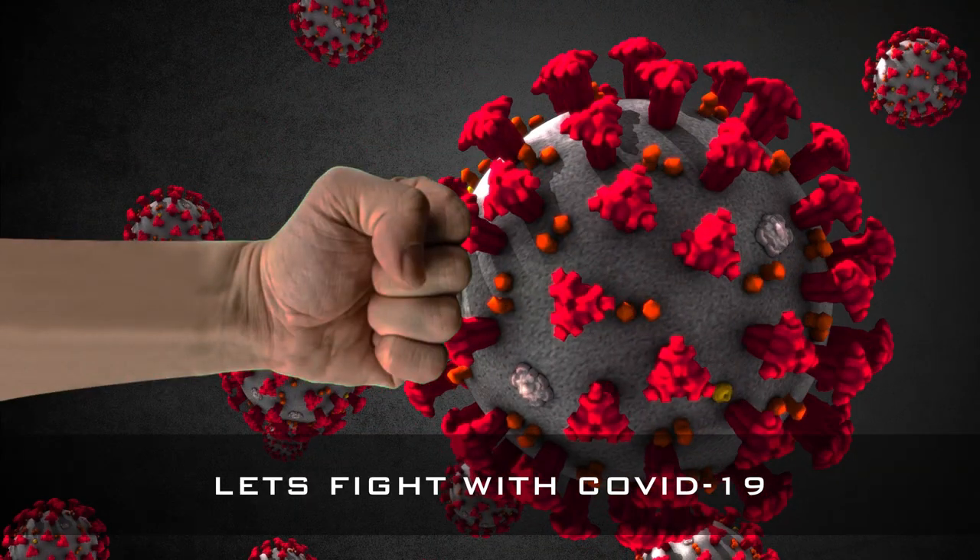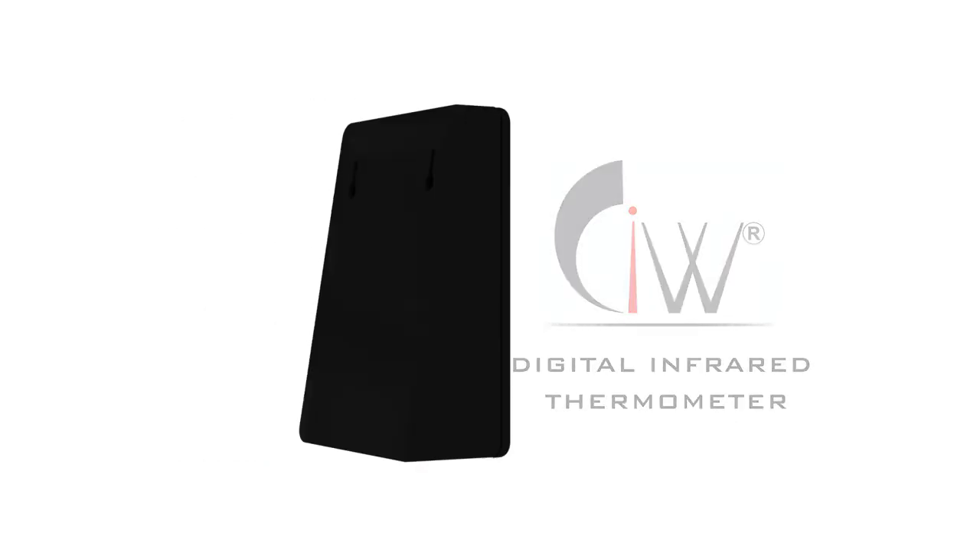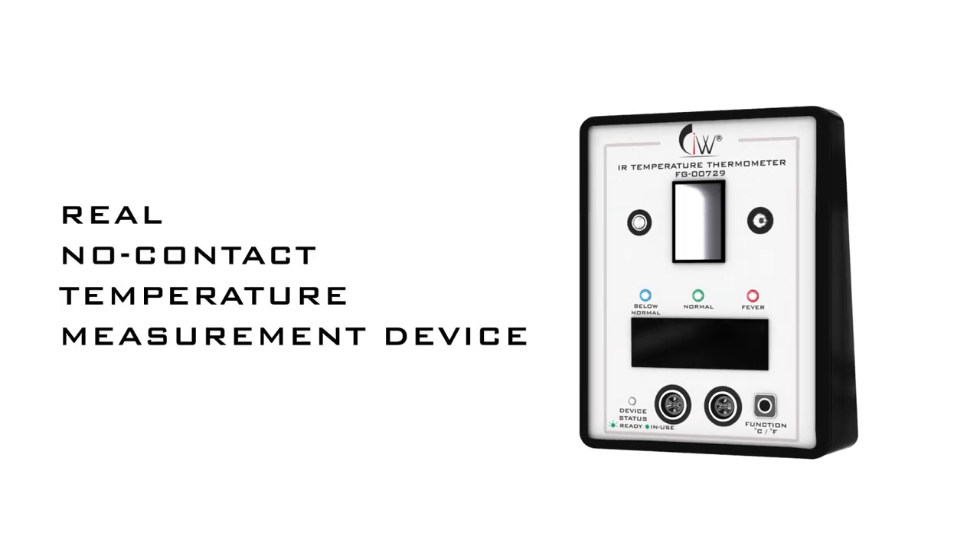Let's fight COVID-19 together with early detection of fever. Presenting the CIW digital infrared thermometer — a real no-contact temperature measurement device that requires no manual intervention.